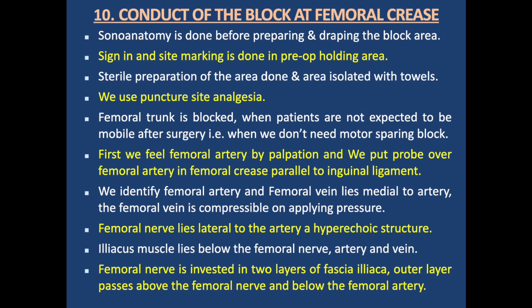First we feel the femoral artery by palpation, and we put the probe over the femoral artery in the femoral crease parallel to the inguinal ligament. We identify the femoral artery on ultrasound image, and femoral vein lies medial to it, and the femoral vein is a compressible structure on applying pressure. Femoral nerve lies lateral to the artery, a hyperechoic structure. Iliacus muscle lies below the femoral nerve, artery and vein.